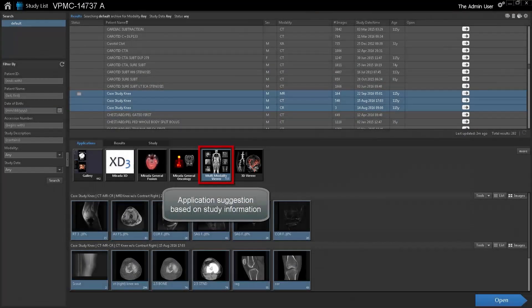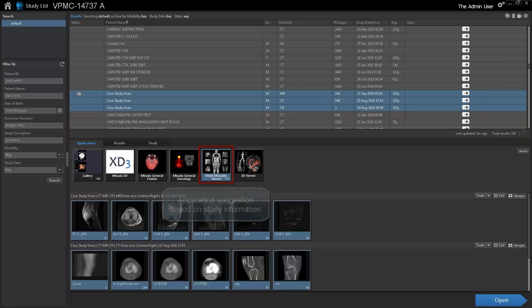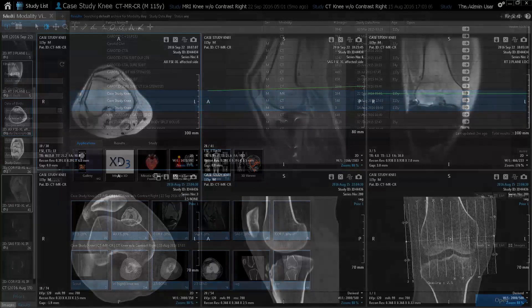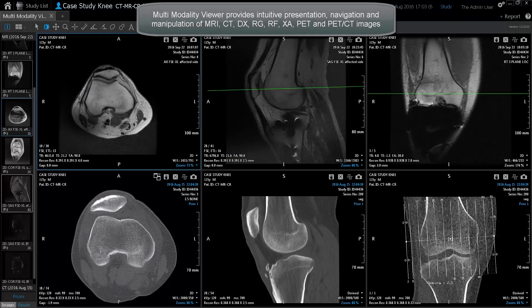Application Suggestion Based on Study Information. Multi-modality Viewer provides intuitive presentation, navigation, and manipulation of MR, CT, DX, RG, RF, XA, PET and PET CT images.